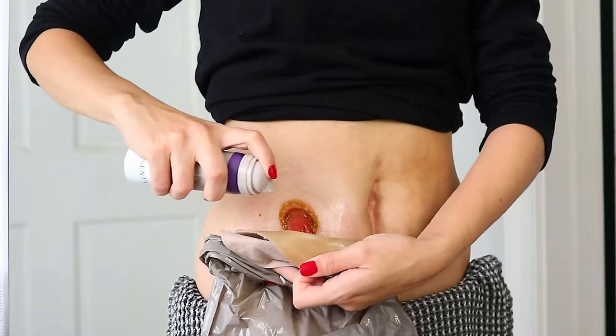I do have two cameras running on me, so hopefully you're able to see my stoma really well and hopefully my stoma behaves. In this video we're going to be talking in depth about removing the old ostomy appliance and getting the skin prepared for a new appliance. I have all of my products laid out beside me here so I can show you them. I may use some, I may not use others, but I'm going to talk about a lot of stuff.